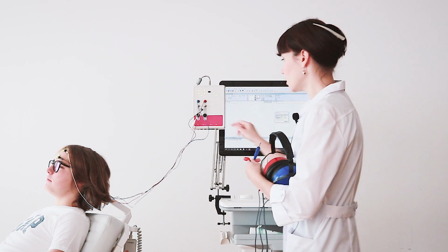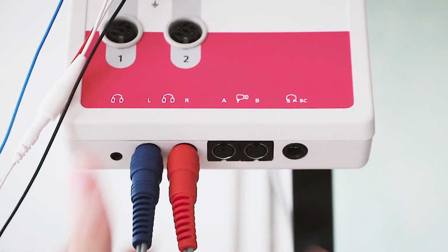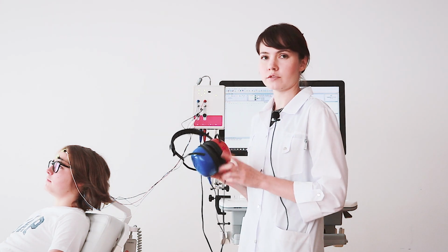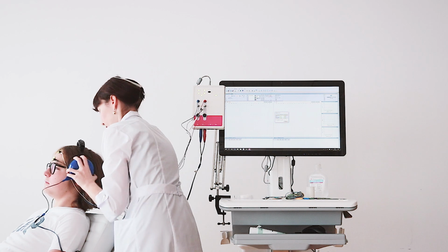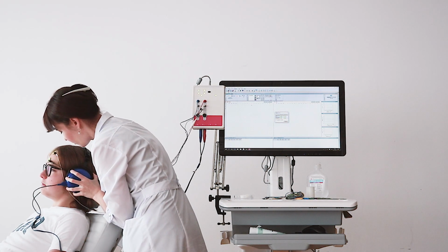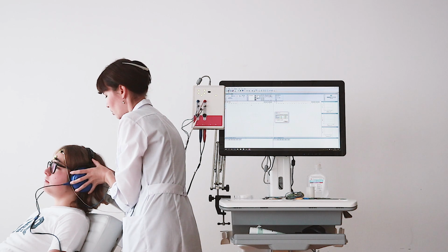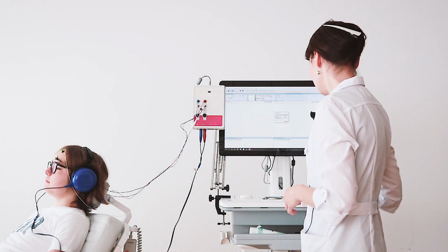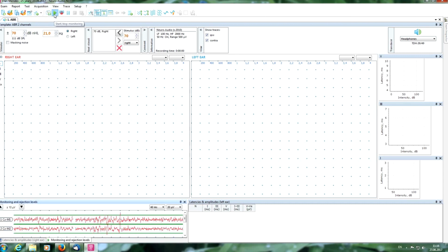Note that the left is blue and the red is right. Also here, the red is for the right ear and the blue is for the left ear. Now we can put it on the head. You can adjust the size to the size of the head of your patient. Now check the signal quality by pressing the monitoring button. It is good, in the green borders, as you can see.